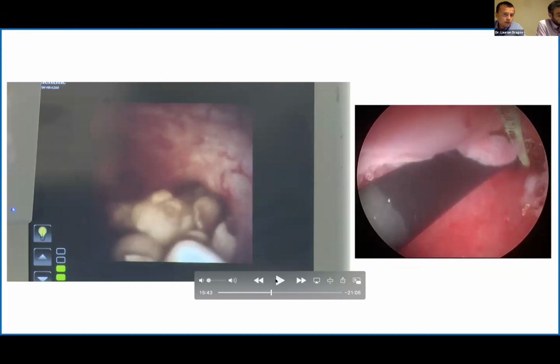Then also the quality of your device, the stone breaking device. If it breaks and you don't have to push too much against the mucosa, and you don't have to move too much, if you have good suction and basically suck the stones to you instead of chasing them, all these tiny details altogether might provide you with more comfort and less bleeding during surgery.